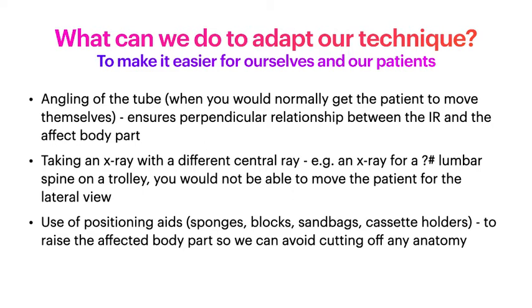So an example of this would be if you have a patient with diabetes and they have a diabetic foot. What can sometimes happen with that is they lose feeling in their foot and ankle, so it goes completely numb. And if you're trying to do a foot x-ray on them to see if they have any osteomyelitis, they may not be able to bend their knee and keep their foot in the same place because they can't feel it, and that's not their fault.